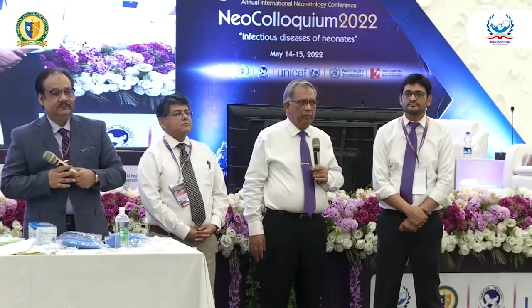If you are not using it, if you are ready to take it out, then you have to heplock it. And the other thing is that try not to give blood and blood products through the PICC line, because the density is very high. So for us, it never blocked. It has to be a continuous flow of fluid because this is a very small lumen, as you can see. So the answer is precaution and maintenance.